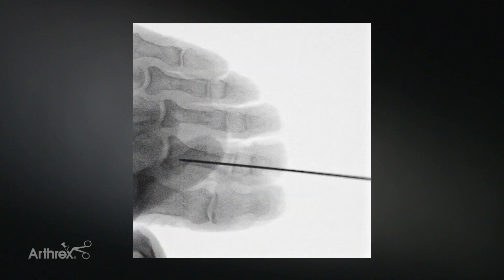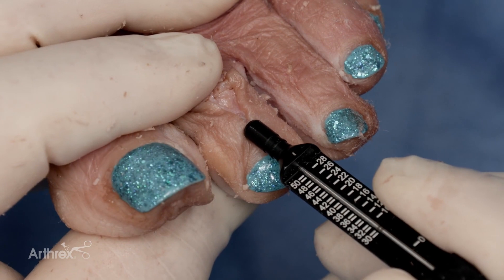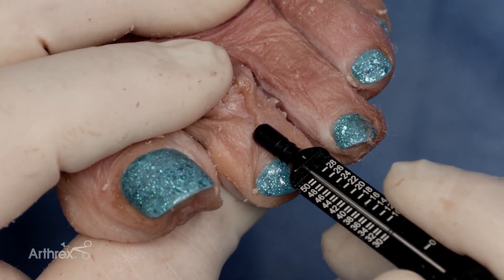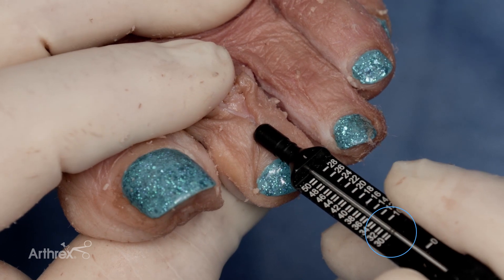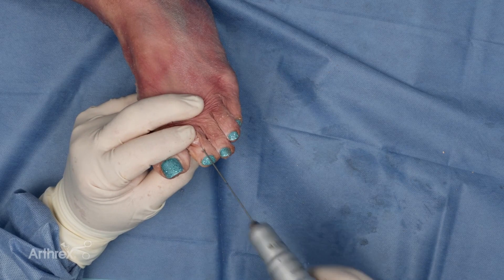This can be checked radiographically. The depth gauge is then used to identify the length for the snap-off pin, then utilized to estimate the length of the implant. The double hash on the K-wire corresponds with 30 millimeters. The K-wire is then removed.